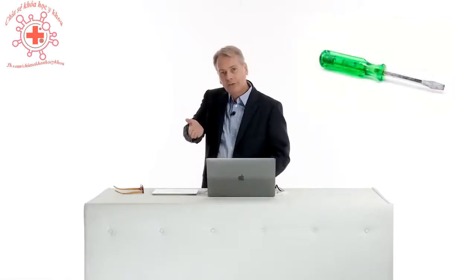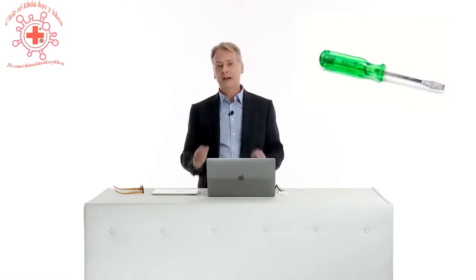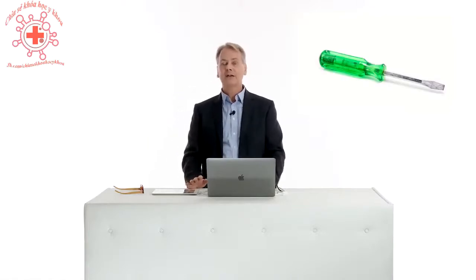There might be several situations where it is not so easy to really get a good subcostal view, especially if patients have tense abdominal muscles or if they have a little bit of a beer belly. Still, if you use the typical motion I showed you in the demonstration, where you use a screwdriver motion, rotating towards the left and counterclockwise, and then of course adjusting the tilt so that you get into the IVC, I'm sure you will get a good view in most of your patients.